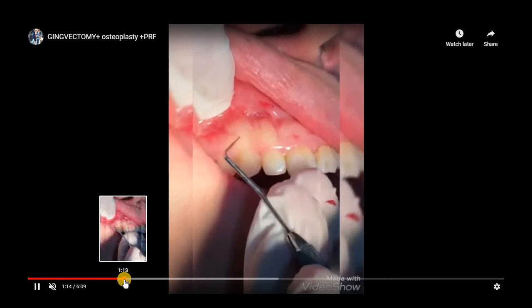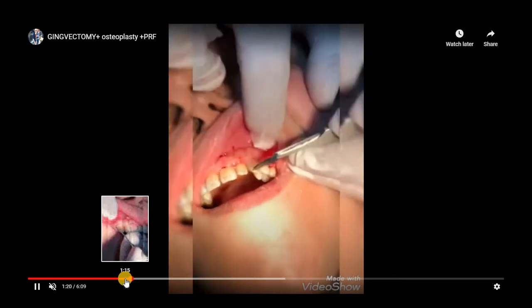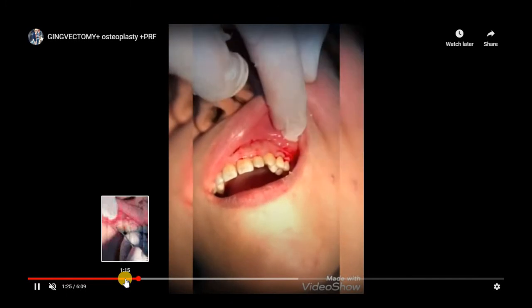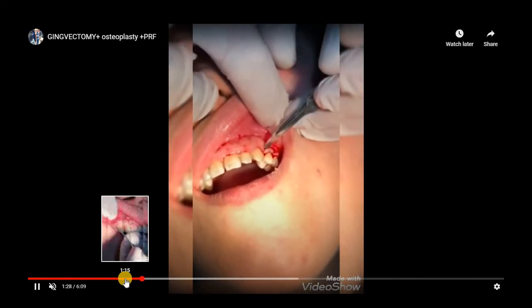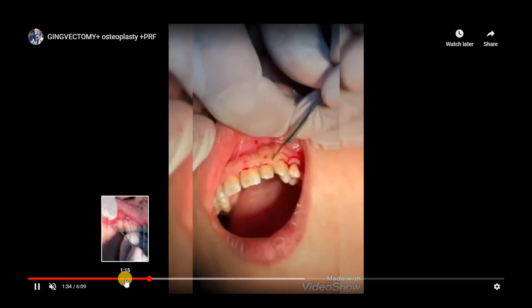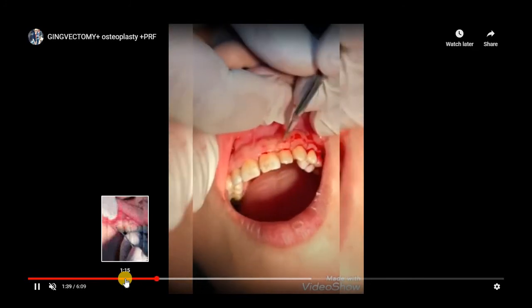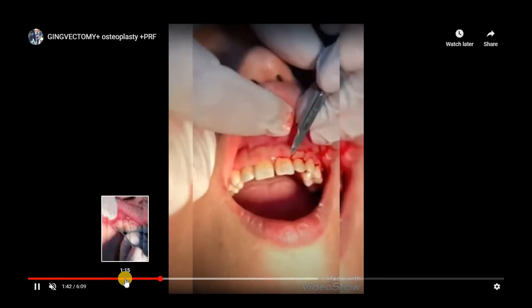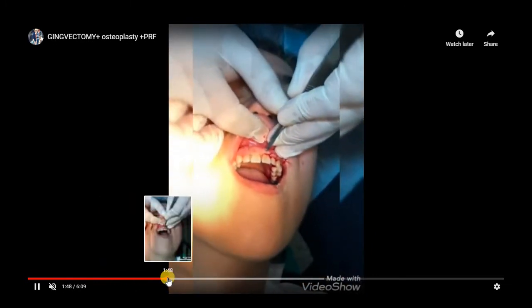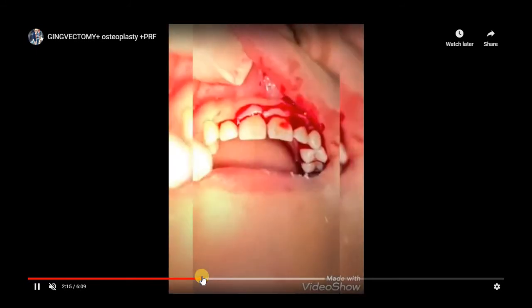We muted it for you to hear my voice, and this is the incision or the excision. The incision is the process of using the blade for cutting, while the excision is the removal of the incised part. As you see my hand, it's at 45 degrees. Like that.